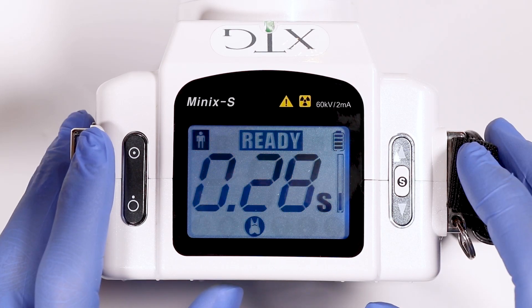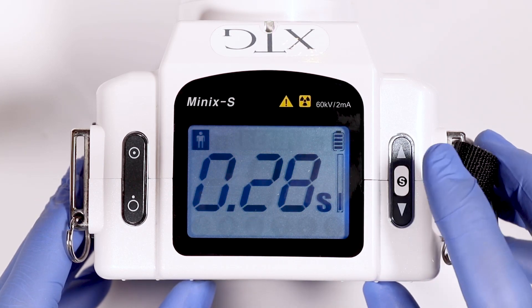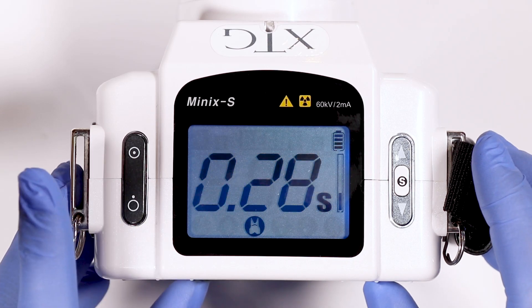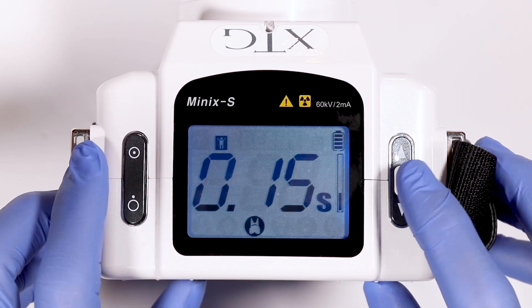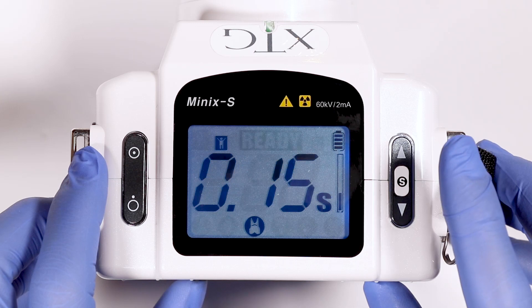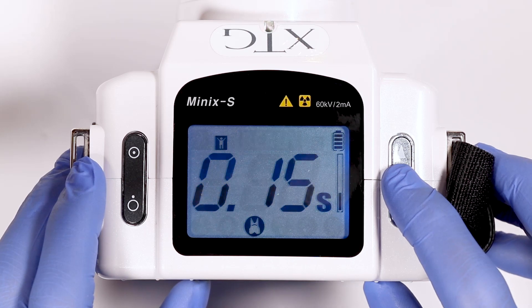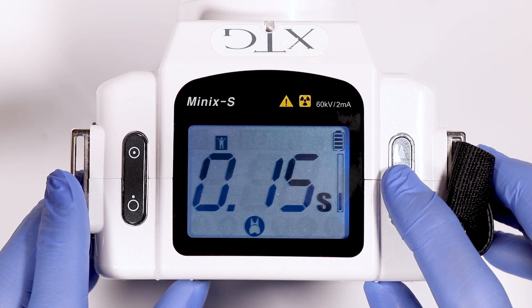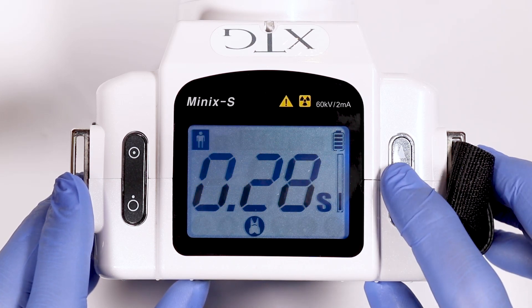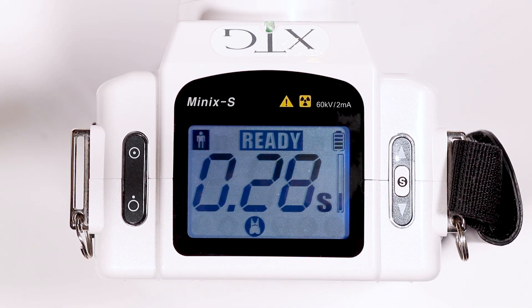To change from adult to pedo, press and hold the S button for two seconds, then press the power off button. The adult icon will flash. Press and release the S button and it will change to pedo. Hold down the S button and it will save to pedo mode. To change back to adult, press and hold the S button, then press the power off button. Press the S button again and it will change back to adult. To save the adult setting, press and hold the S button — it will save and you will see the ready sign.